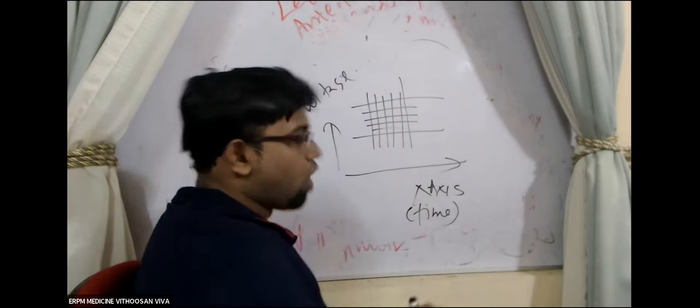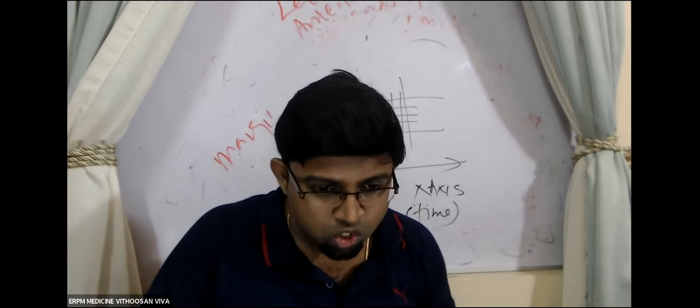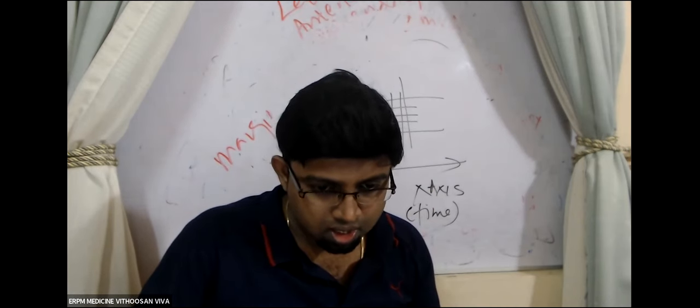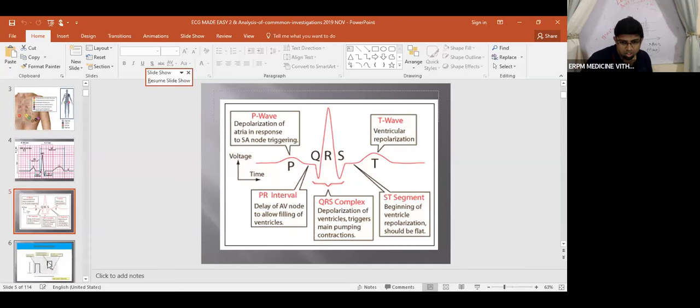In the y-axis, you are plotting the voltage. I'll discuss a lot about this in the next class, but just to show you some small points.